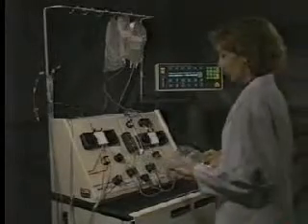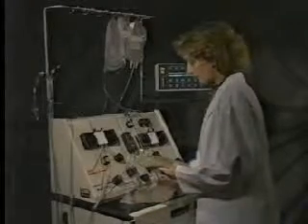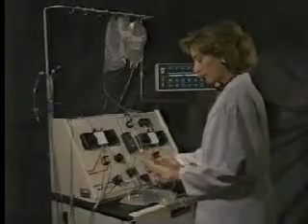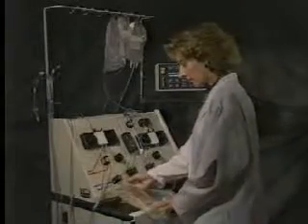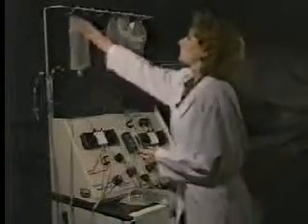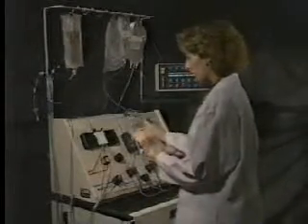The disposable set does not include anticoagulant or saline. These containers need to be obtained from your supplies. Consult your operator's manual for the proper solutions. The anticoagulant bag should be hung on the hook farthest to the left. The saline bag should be hung on the next hook.